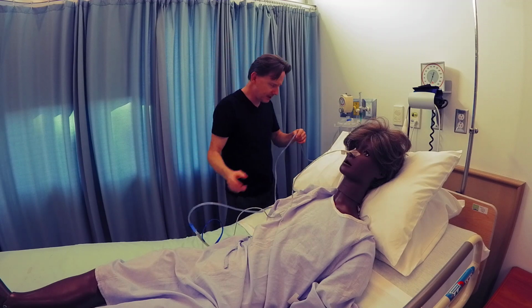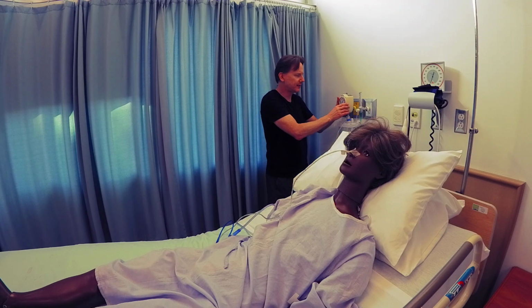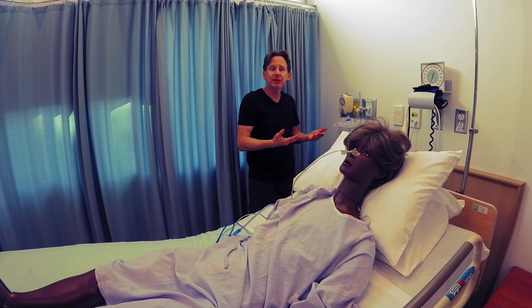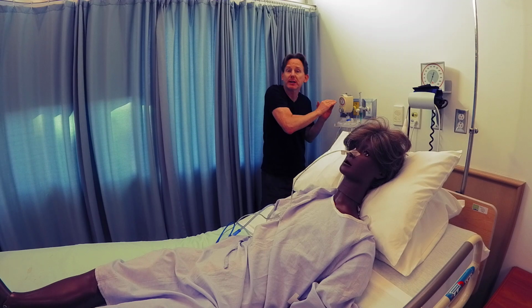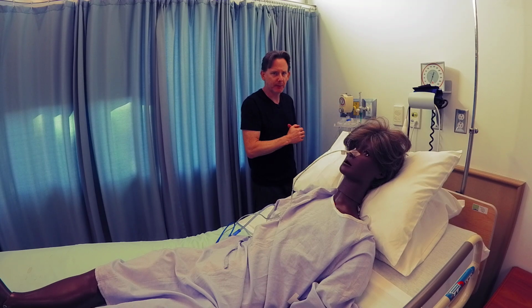And you keep assessing, you're looking at your suction tubing now and seeing if there's any flow through here. Then of course you get to the suction machine itself and you're seeing that it's set. Usually what's ordered is a low suction rate. It could be low continuous suction, or it could be low intermittent suction. Often low continuous. And low suction means 40 to 80 millimeters of mercury. Now it's okay if it's at 40. It's okay if it's at 80. Anything between those two numbers is going to achieve the necessary suction to empty out the stomach.